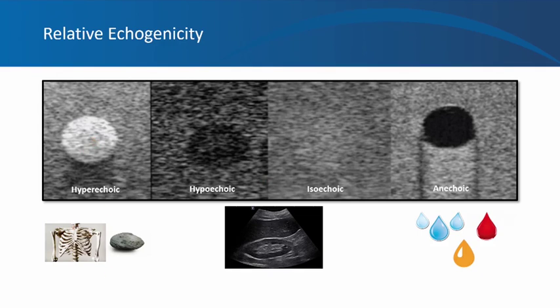Examples of bright structures you'll encounter during abdominal ultrasound include stones, bones such as ribs, fibrous structures like the diaphragm, and renal sinus fat. Note that stones and bones don't let any sound waves pass through them, so they form a shadow beneath them. Fibrous structures such as the diaphragm or renal capsule still allow some sound waves to pass through, so there will be no shadow, but these structures still appear bright.